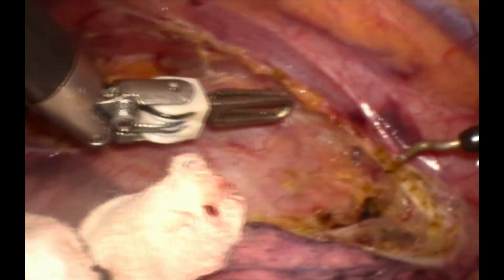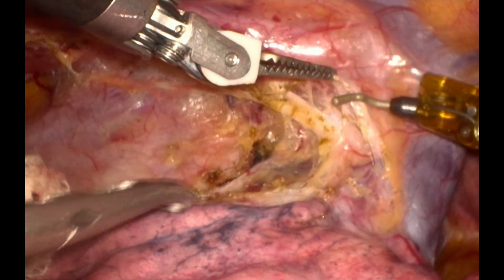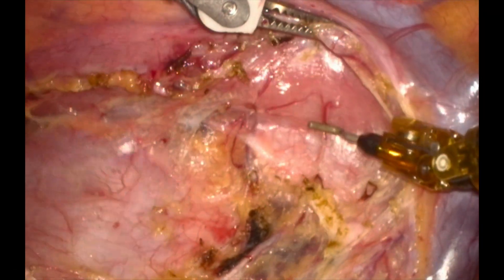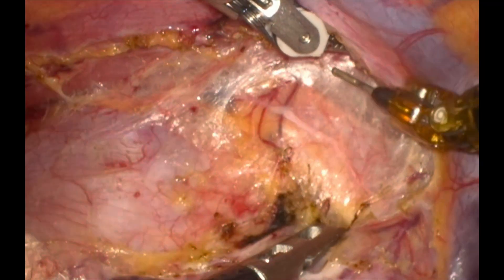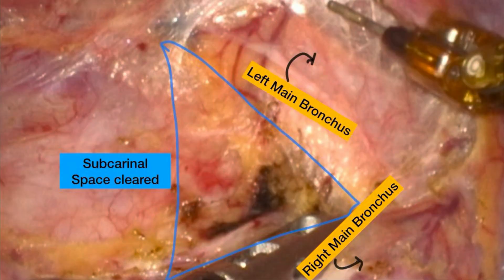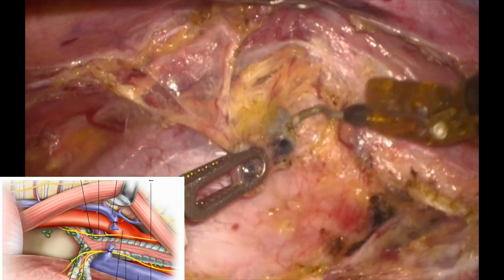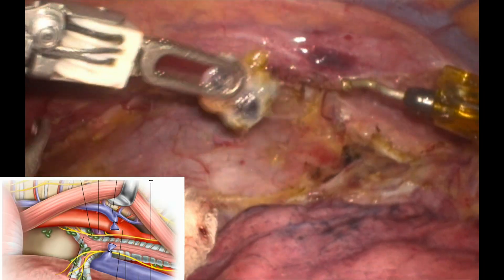The inferior dissection, once done, continues superiorly to the carina. Be careful and identify the bifurcation of the trachea. Here you can see the vagus nerve, which is divided after it gives branches to the tracheobronchial tree. This is the most critical step as you create a plane between the left main bronchus and the esophagus. You have to be careful not to injure the posterior membranous part of the left main bronchus, and all the lymph nodes seen are taken along with it. The dissection is continued till the opposite contralateral pleura. Small branches to the lymph nodes are cauterized to avoid any bleeding.